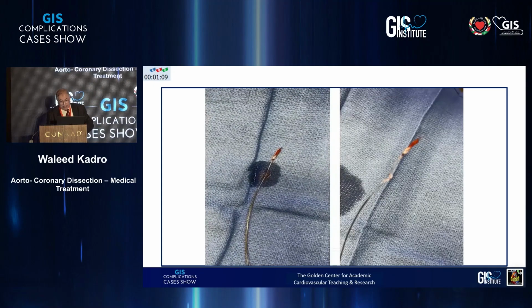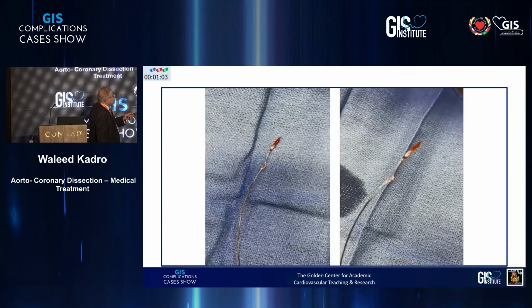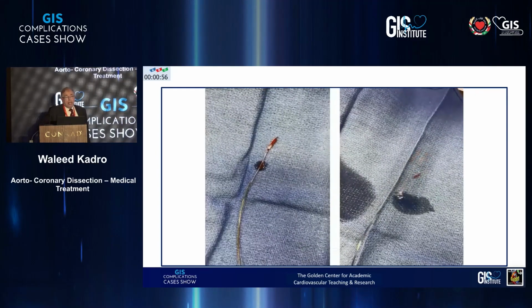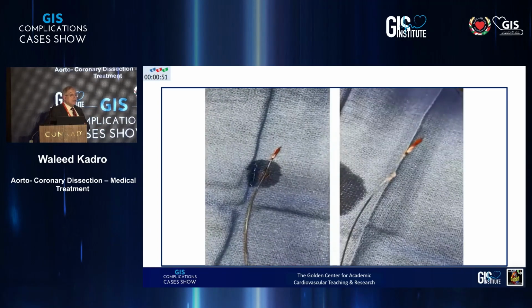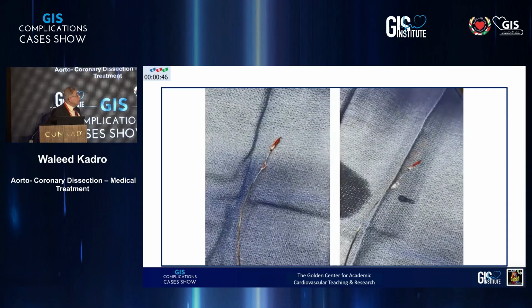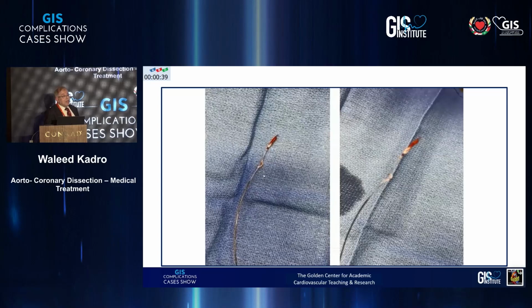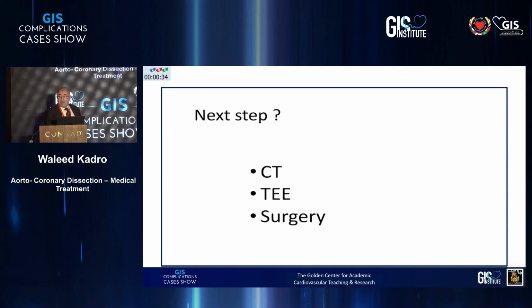Where is that laser point? Okay. The balloon. So this is a shaft rupture and barotrauma at the shaft that caused this dissection in the aorta. And this is not a balloon rupture. I'm sure everybody agrees. This is a shaft rupture, and this is not a balloon rupture. So this is a rare mechanism for developing aortic dissection.